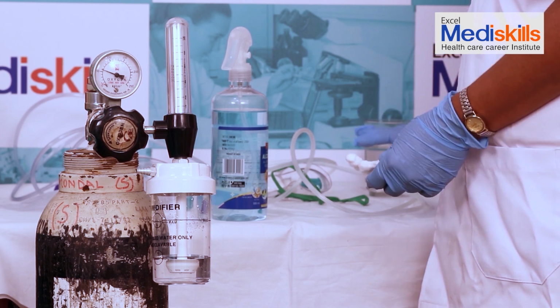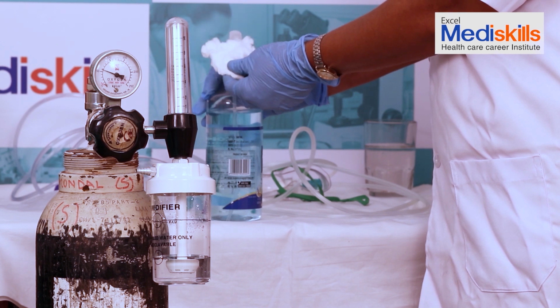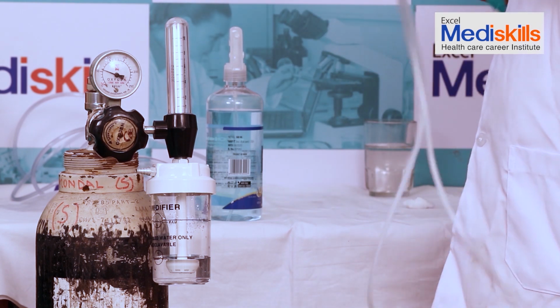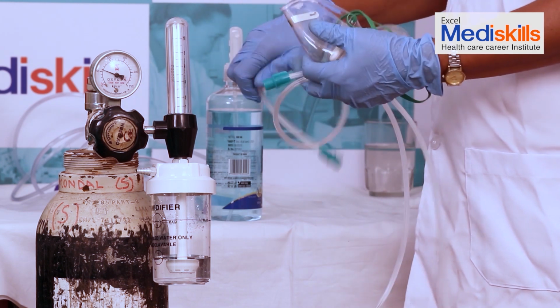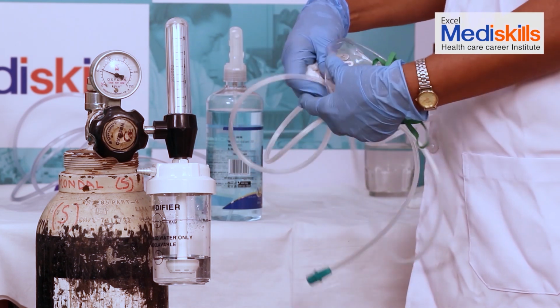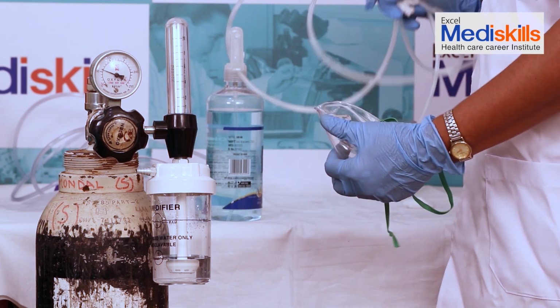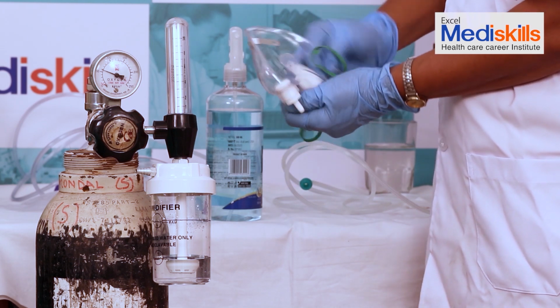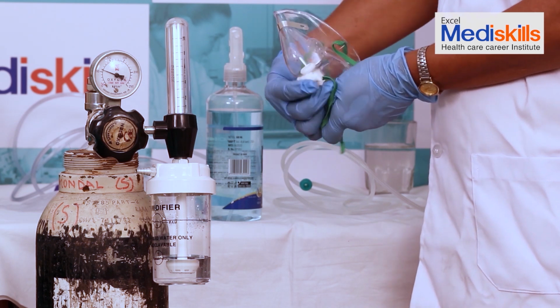Now we will disinfect the oxygen mask. Here we take cotton. Now we pour alcohol from the bottle on this cotton. Now I will disinfect the oxygen mask. Firstly, I will disinfect the nasal trip. After that, we keep it aside here. Then we will properly clean the inside of the face mask with cotton and alcohol, especially where the adapter is.